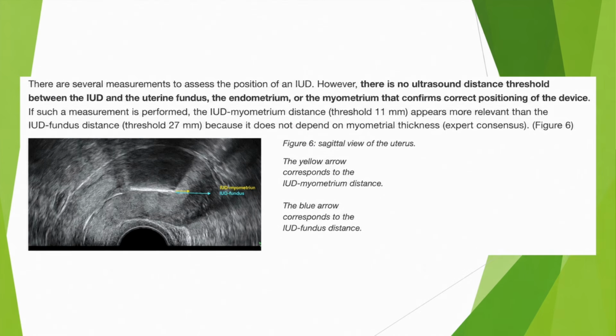There's a second measurement, which is shown here on this slide. It's the measurement between the device and this time the myometrium. It's harder to see with the suprapubic approach, and also harder to see if your patient is obese, but on the other hand, it also has its advantages. In cases of fibroids or multiple pregnancies with increased myometrial thickness, it helps to get around this obstacle. And as a result, you can be really sure of the position and relation to the uterine fundus.